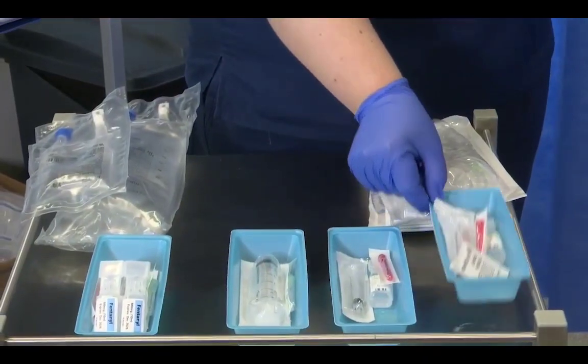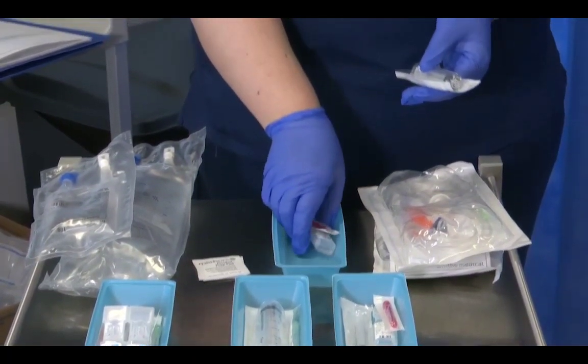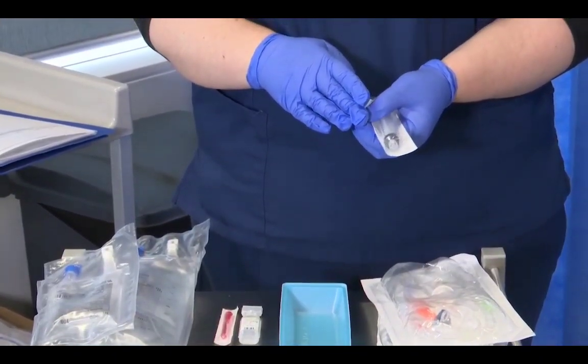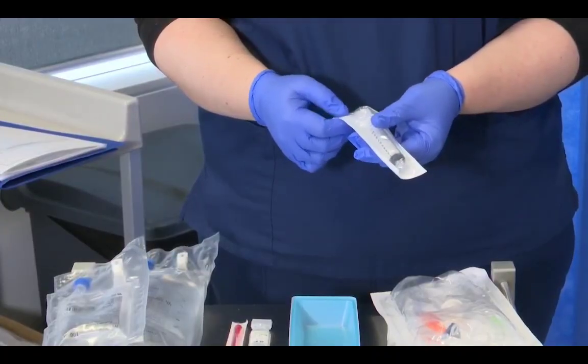So the first thing I'm going to do is collect my tray for my flush. Remembering that we can recap our needles, but we have to do it through fishing for the cap in the tray. As such, nothing can be in our tray so that we don't touch anything with that needle.